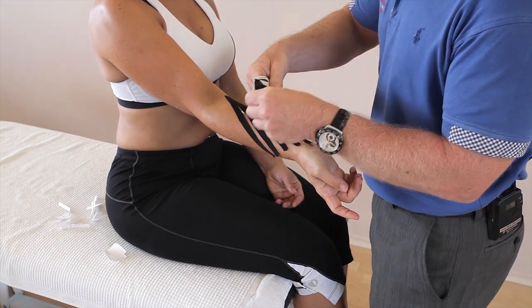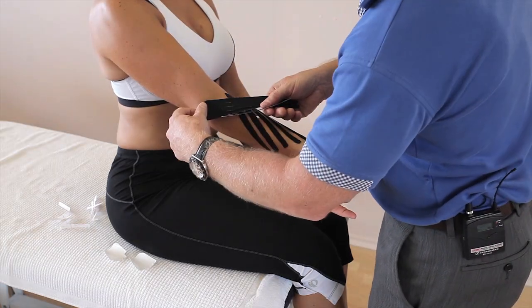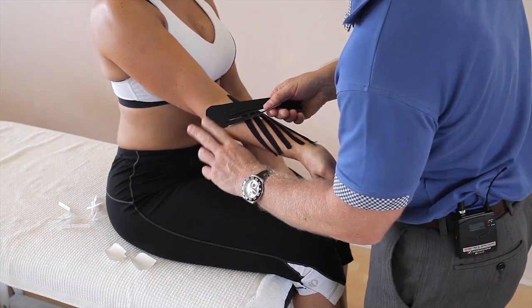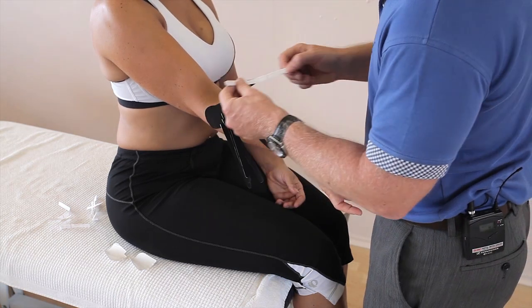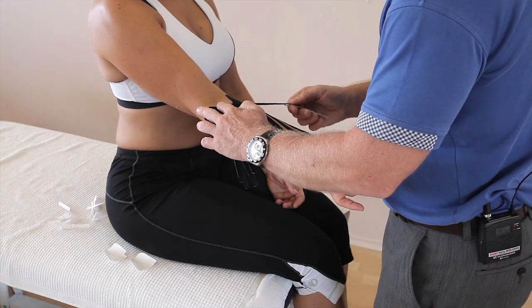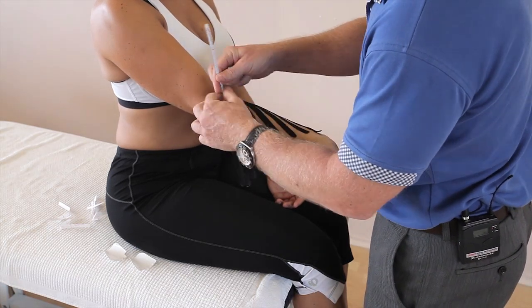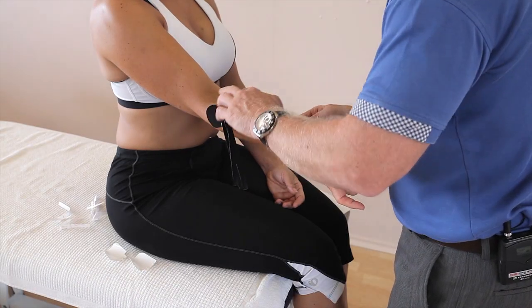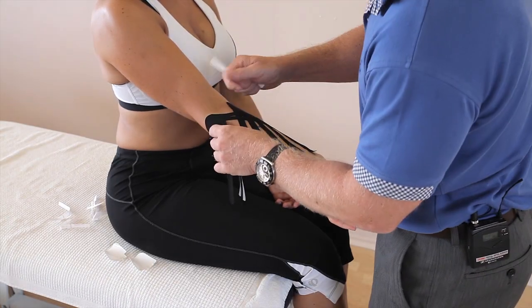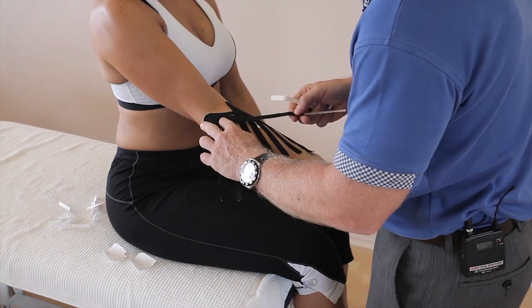Again, break the individual fingers and then apply that like so. These fingers are going to cross the fingers of the first tape. Let's do the second finger — it's a little fiddly, but once you get used to it, like everything, practice makes perfect. And again, cross it over.